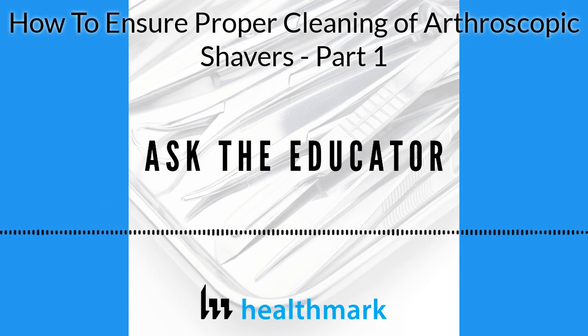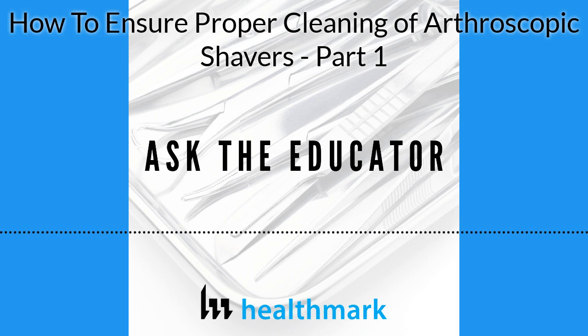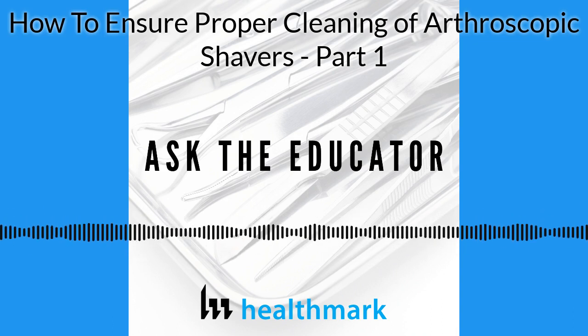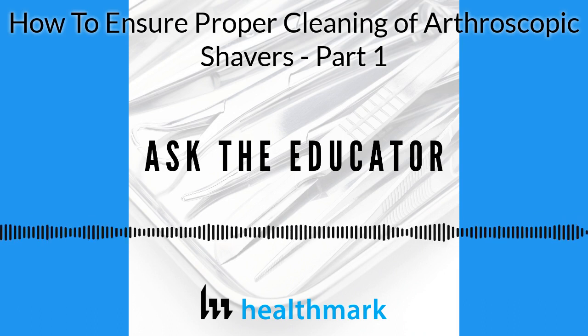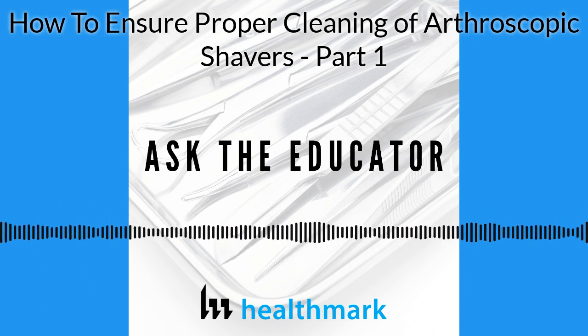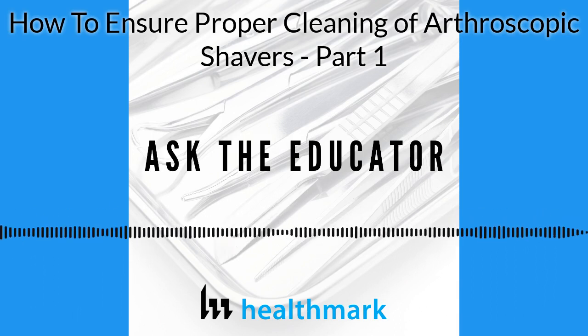But there's something else that I think we'd like the medical device reprocessing professional to remember, is you want to document it. Now, you've used a lot of the computer systems that are out there. Unfortunately, I'm not as good at them as you are for the instrument tracking, but I think you could put a task or something on there, like you did inspect it and you check it off or something. Is that how it works, where you can get that documentation to show that I was the assembly person and I did it? You think that's possible in a lot of these systems that are out there, Kevin?